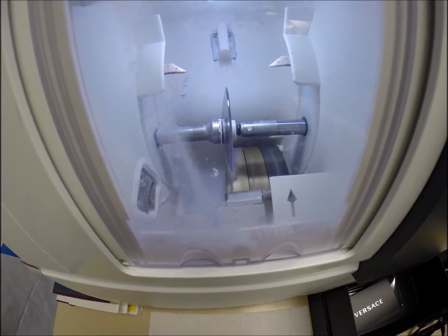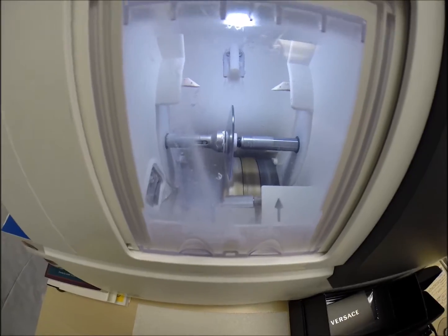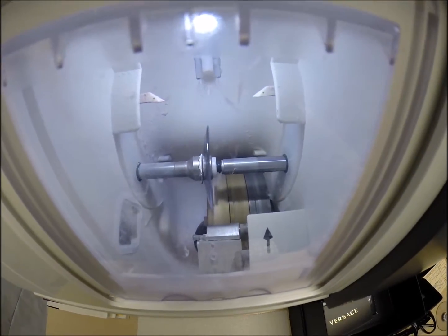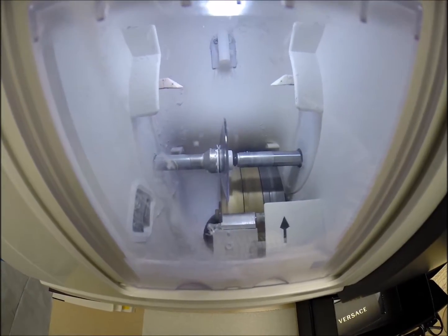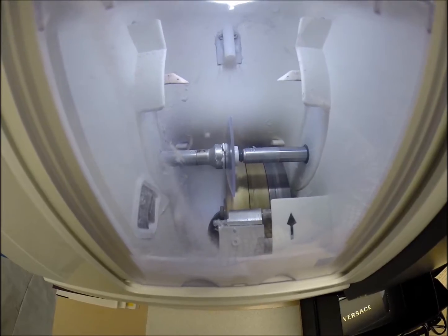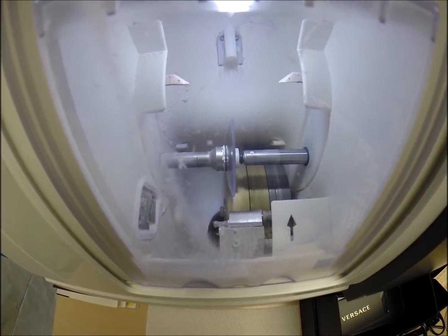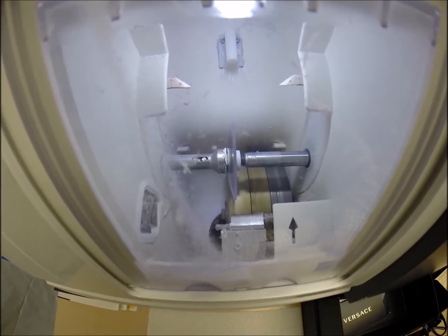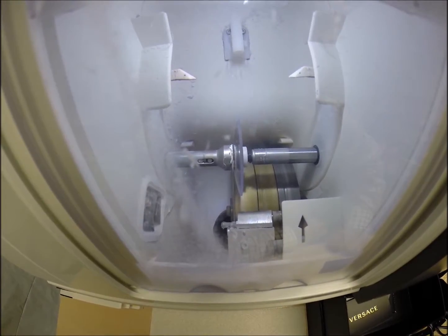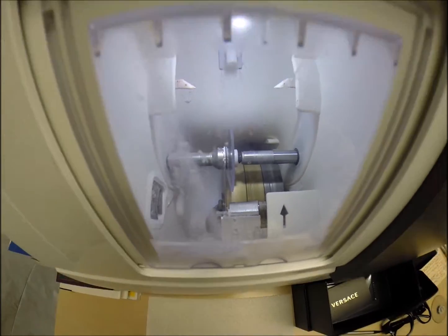Now if you see light flickering in the background, that is water there to catch the optical sawdust. Polycarbonate lenses cut dry where plastic, high index plastic, and Trivex cut wet, meaning that water sprays onto the lens for the duration of the cutting cycle. Polycarbonate lenses cut dry, however water will spray onto the lens for the last 20 seconds just to wash away any optical debris. You may begin seeing the form on the edge of the lenses.